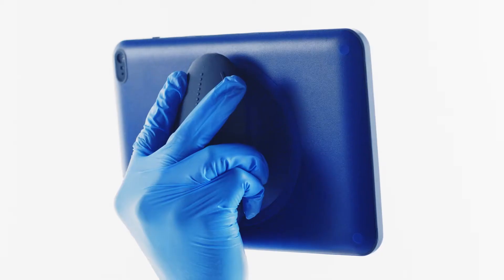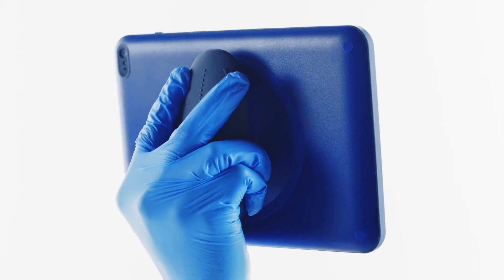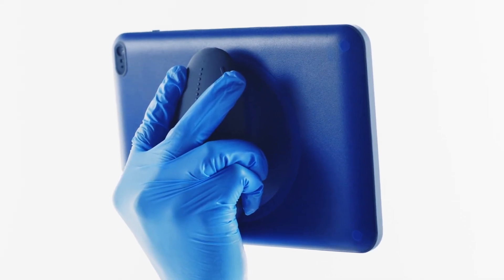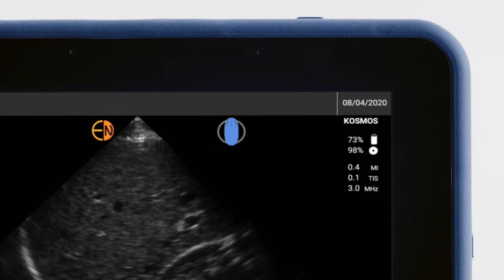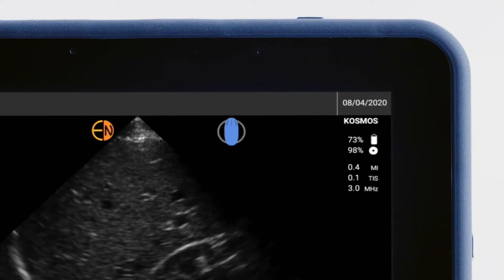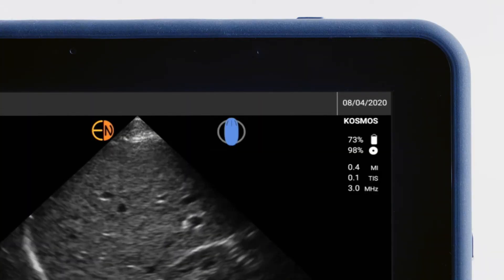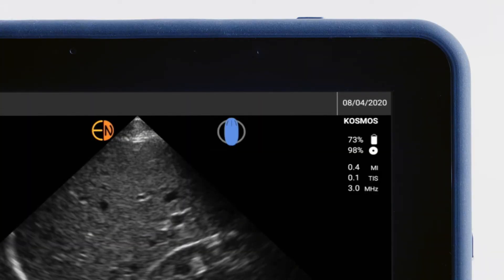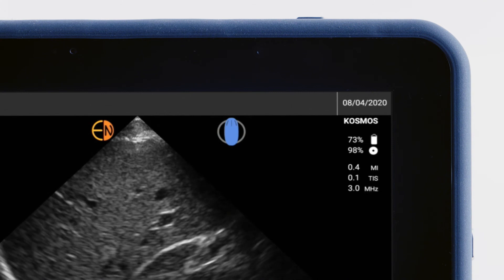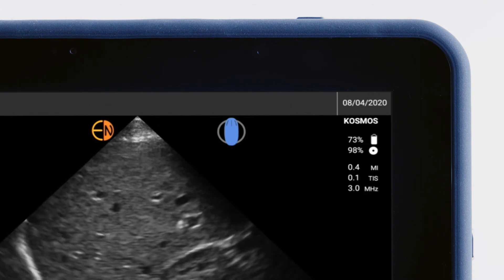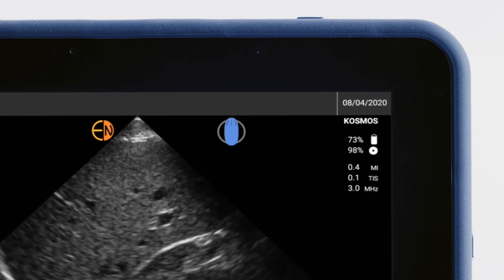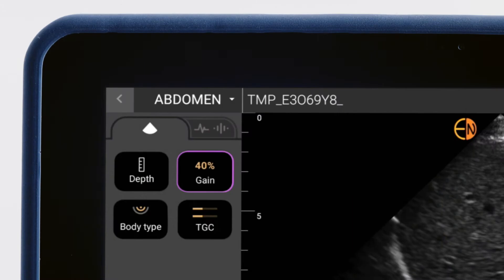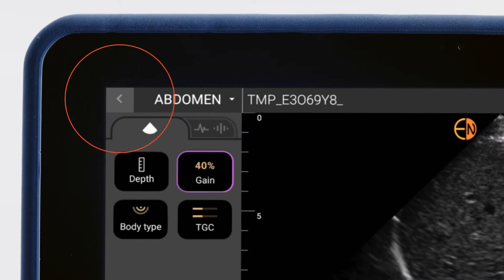You may also use handle controls to adjust gain and depth and capture images. The blue handle control icon indicates that handle controls are activated. If you do not see this icon, the handle controls are not activated and must be turned on in the home screen, which you can access by tapping the back arrow.